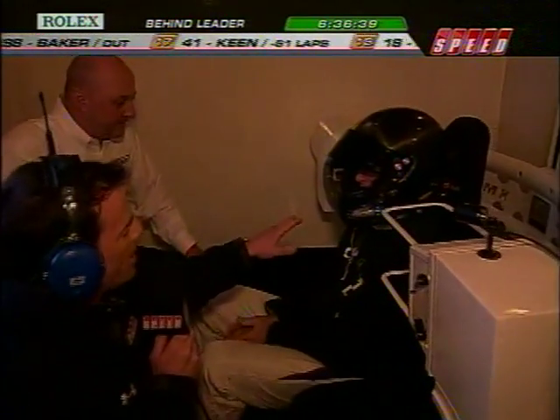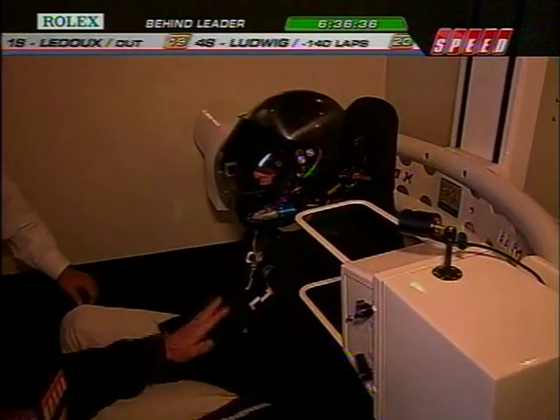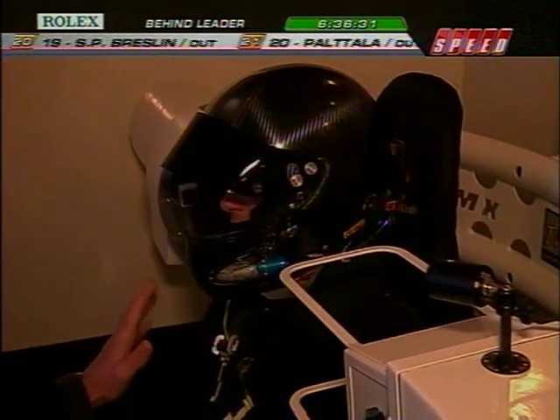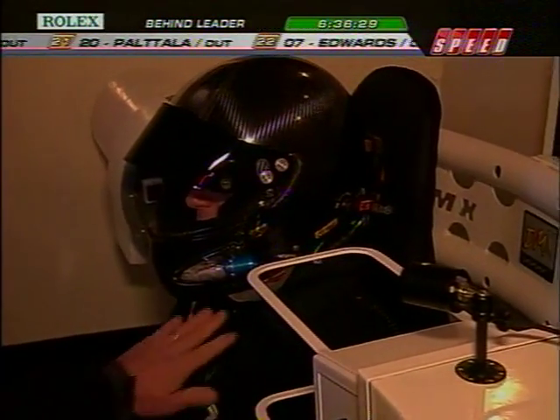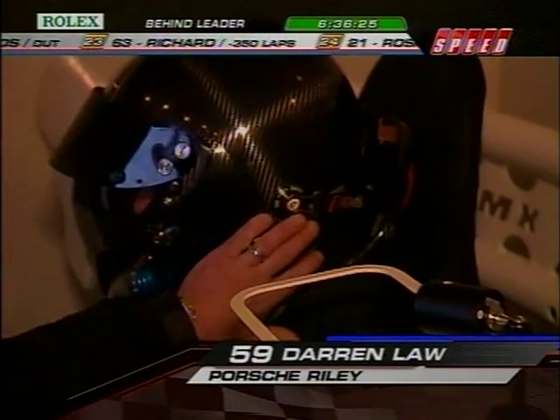What we've got right here, Darren Law being our guinea pig for us, sitting in a race seat, buckled in, helmet on, Hans device on, but also inside a motion x-ray machine. This machine can take 30 images per second looking at Darren's neck and skull, and what they're trying to do is make this fitment of these tethers really personalized to Darren.